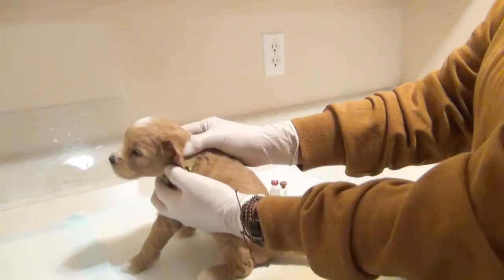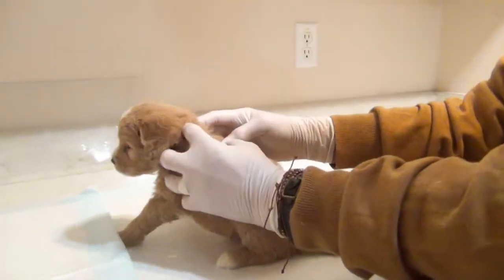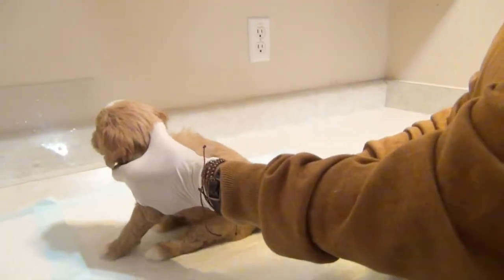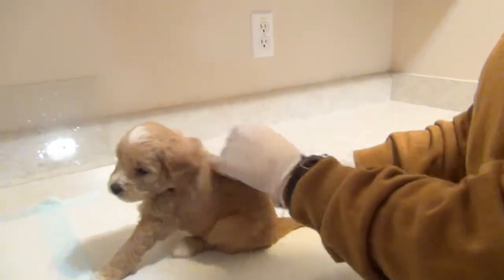Puppy lovers, puppy breeders, puppy buyers — whoever needs to know this information — I'm just going to show you simply how to give an injection into the scruff of the neck.